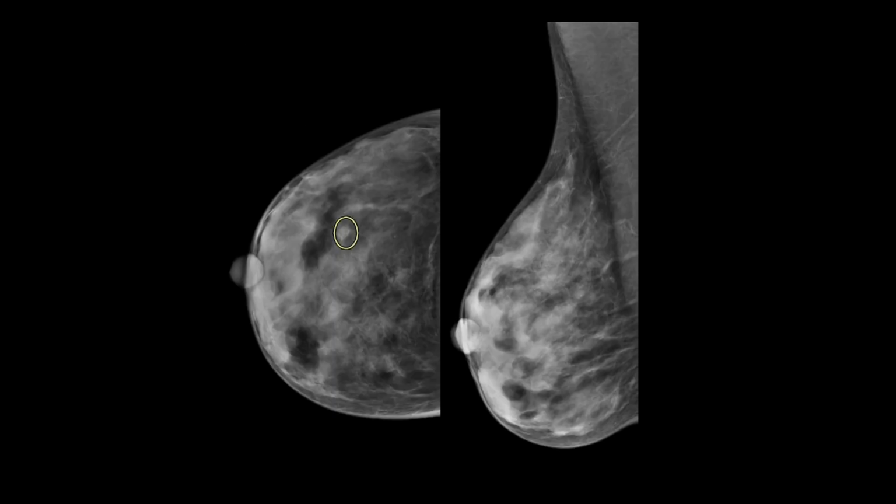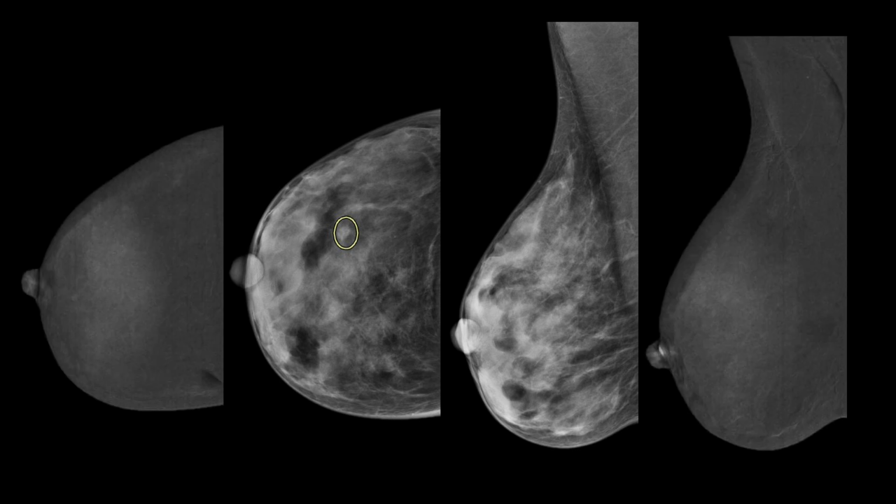And now I'm taking you to a whole different scenario, which is an asymmetry only, detected on screening mammogram. Do spot views here? Yes, we can do tomo. It did not persist. But the radiologist has a very difficult time sending the patient away with such dense breasts, even if there is nothing there. If you do that, you say it's negative. It's so much easier, yeah?